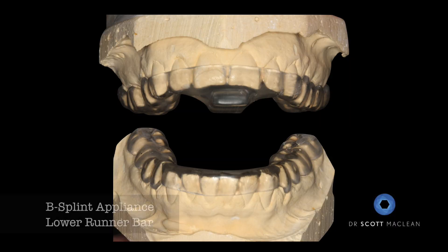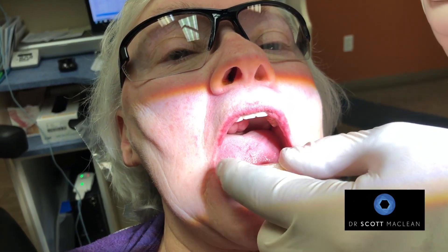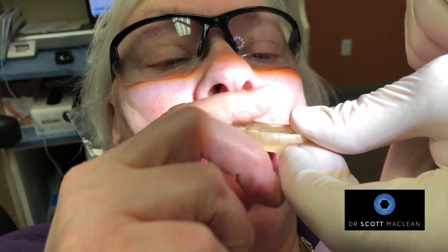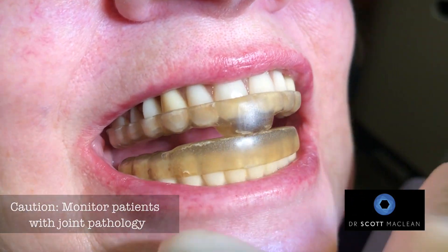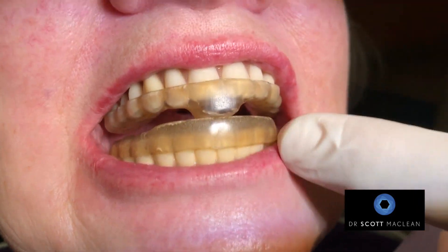Our goal is to make this so she's not going to clench. We made a B splint, and the B splint has a lower runner bar — from the canine to the canine — allowing the support to be on this. On the upper, we put that in, and when she bites together you can see she's not getting any pressure on the posterior teeth. This is really important — it's going to turn down the elevator muscles: the temporalis, the masseters, and even the pterygoids, so she's not going to have the pain up inside that she usually had.